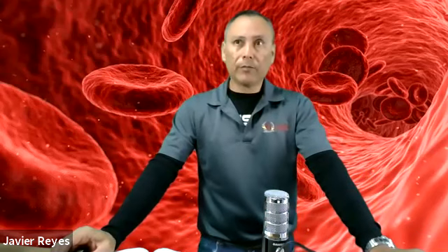So you have to have this very thin layer so that the technologists can count the number of cells. Obviously, they count a very small area, and then they have their formulas to perform that test. But again, it's not done very routinely, and there are machines that can do it for us, and they do it perfectly every single time.